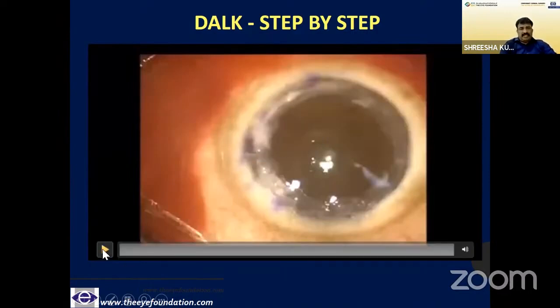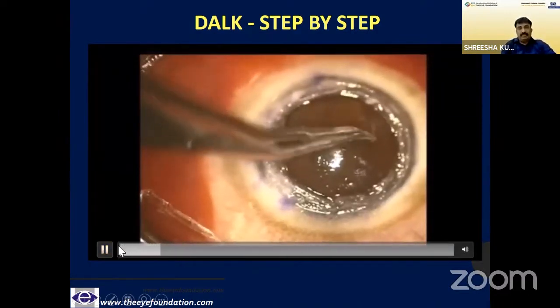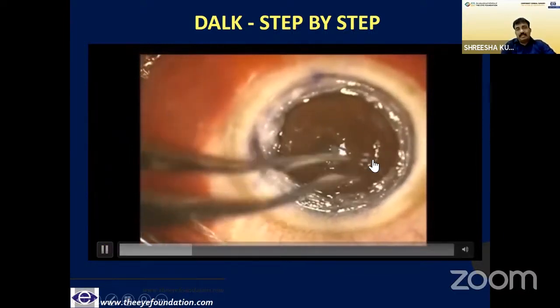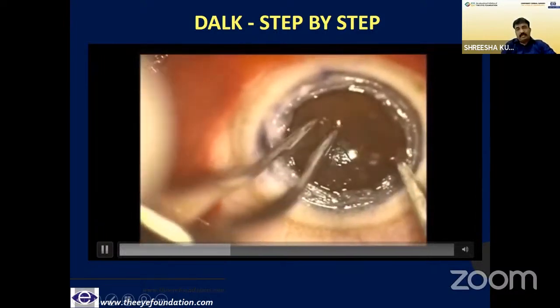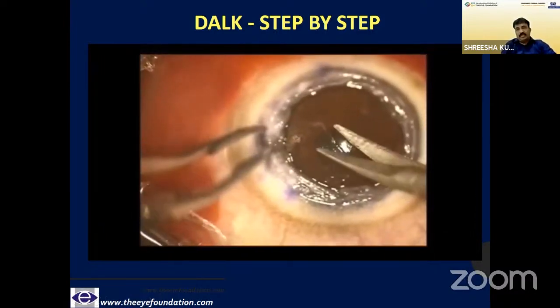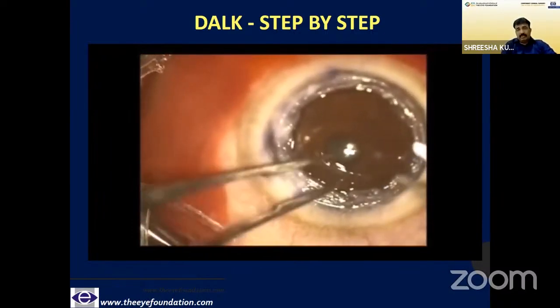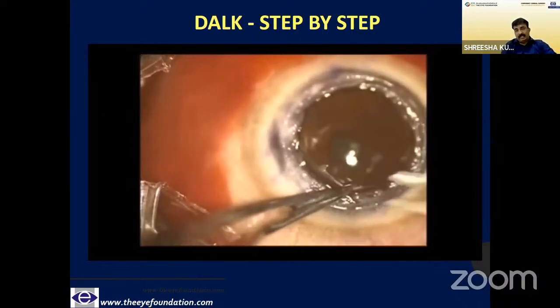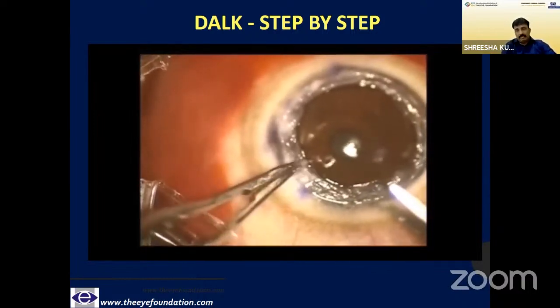This is a very old video of mine, almost 15 years old, and I have reached Descemet's layer. This is a DM layer which I should not have done, and I'm using a sharp instrument also. Very enthusiastic about it, and I even showed this video to Dr. Dua in a Kakon meeting. He also appreciated it, but I didn't show the later part of the video. It's only up to this I have shown.